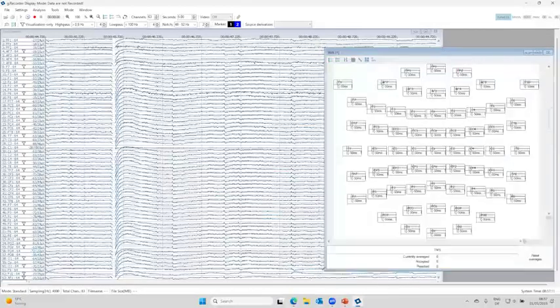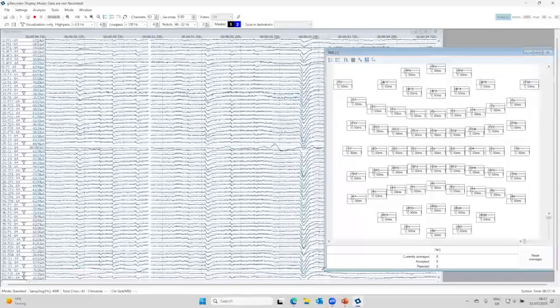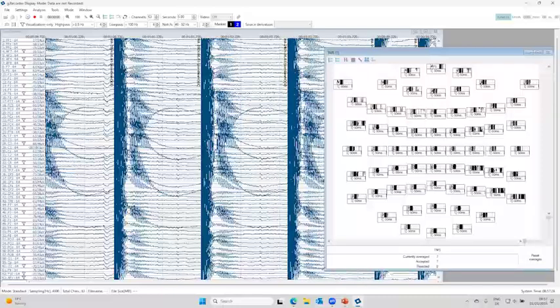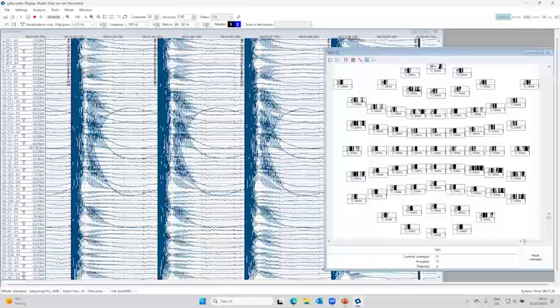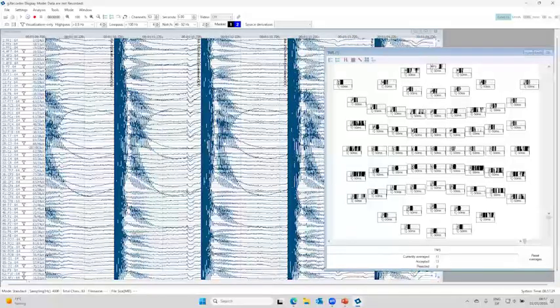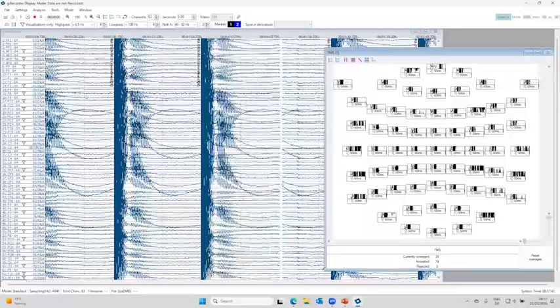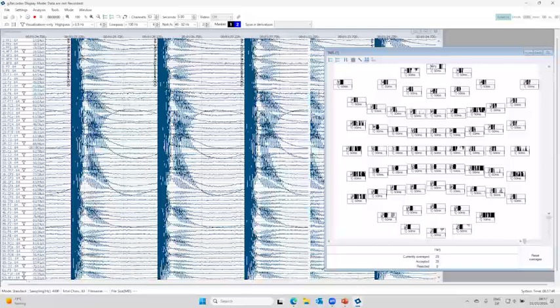So you will see over here, this online artifact is pretty big, but what is important is to count the trials. So we have already 3 trials, 4, 5, and so on. So how are we doing with the time? I'm almost done. Usually you would make like 100 of these trials or more. People do usually between 100 and 200, depending on the area they're recording and the signal quality. But this is essentially how you do the TEP acquisition.